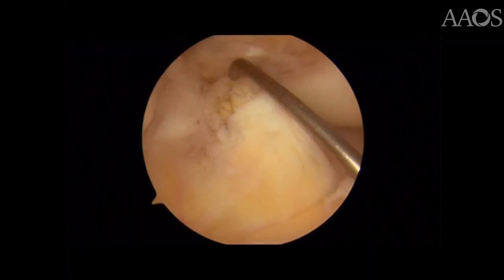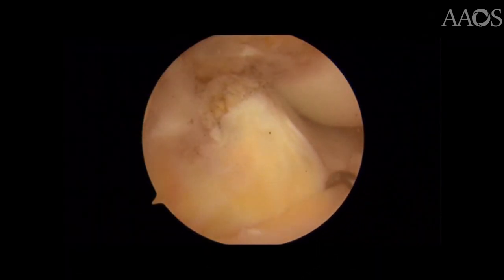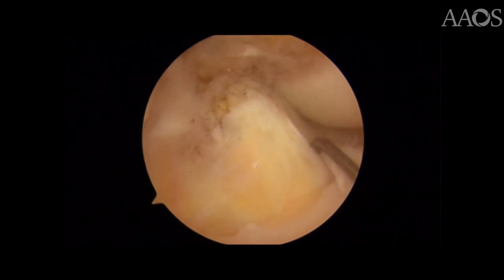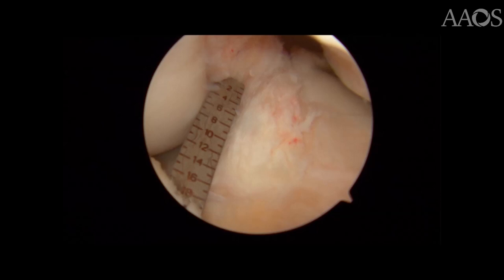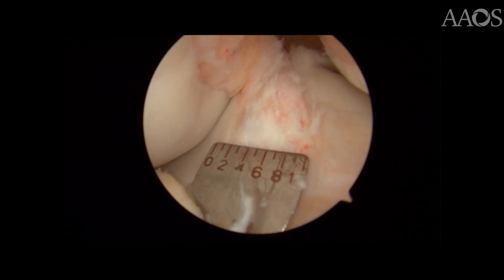Good arthroscopic visualization and a probe outline the ACL tibial footprint. A trocar gauge is shown here to demonstrate the length of the ACL tibial footprint. Similarly, the width of the ACL tibial footprint is measured.